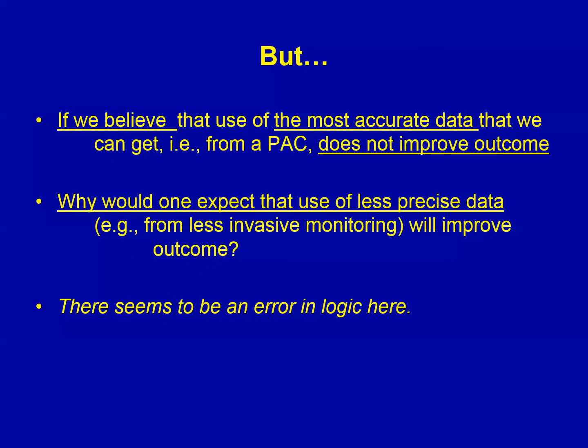However, if we believe that the use of the most accurate data that we can get, in other words, that from a pulmonary artery catheter, doesn't improve outcome, why would we expect the use of less precise data from these less invasive monitors will improve outcome? This seems to be an error in logic.